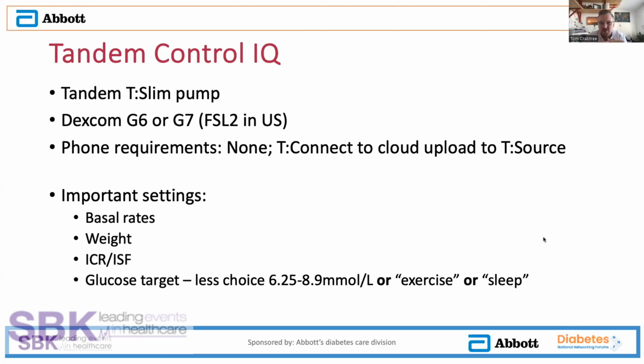The settings for Tandem are probably more important than for the other pumps, which do a lot more learning and machine learning than the Tandem does, which doesn't do any, in fact.